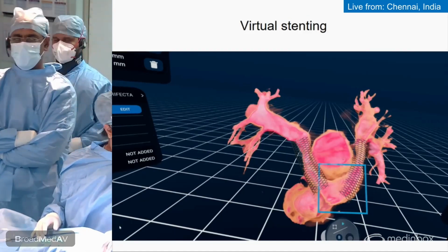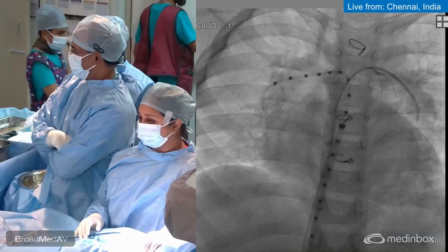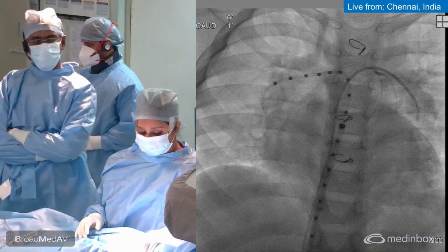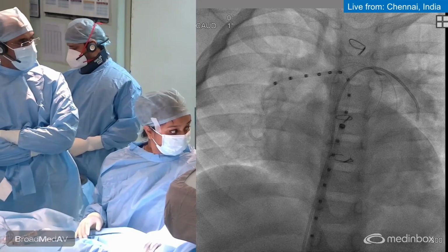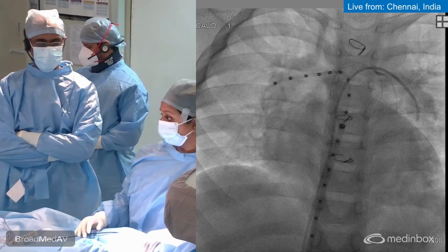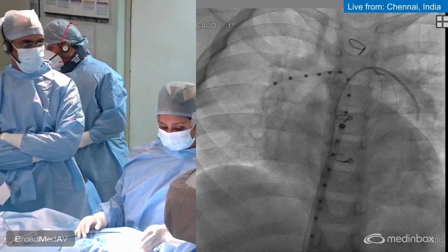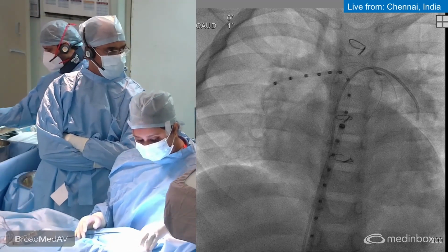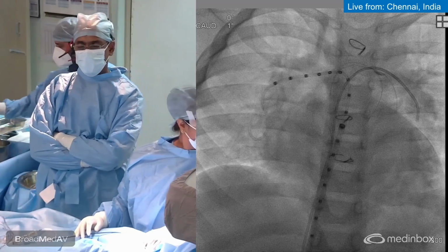So in this procedure, we have, as I previously mentioned, Dr. Tejasvi, who is assisting me, and Sister Christy is our scrub nurse. Prabhu and Surya are our radiation technologists, and Dr. Uday Charan, who is our intensivist, who is managing the patient with a small dose of dexmedetomidine running. The patient is under sedation, breathing spontaneously, and as I speak to you, the saturations are around 100%.